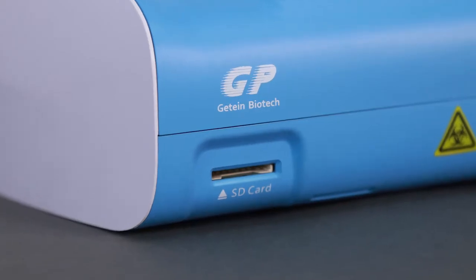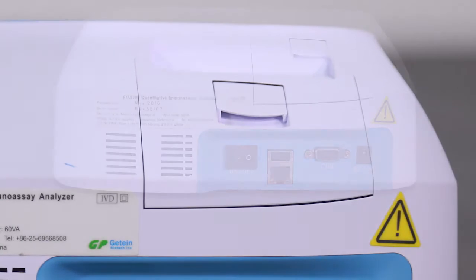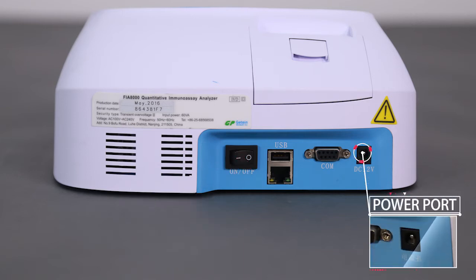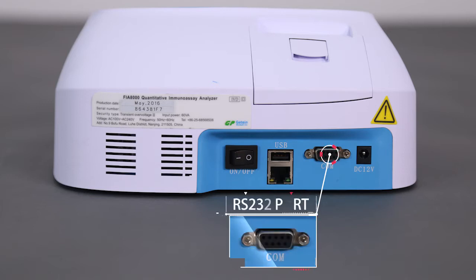Insert an SD card into the slot to test the slot and the mini printer. The rear end of the instrument has a power switch, power port, USB interface for system upgrade and optional barcode scanner connection, as well as an RS232 port for the connection of a host computer and a LIS/HIS system.